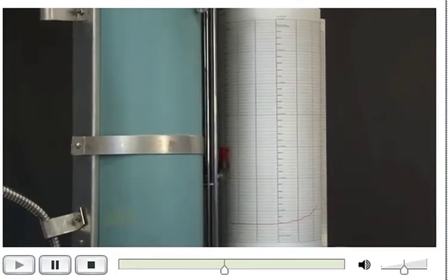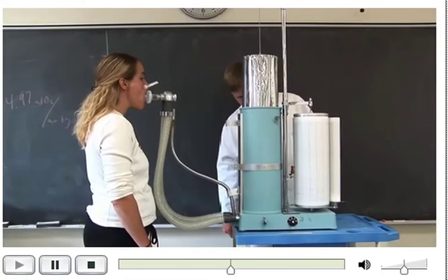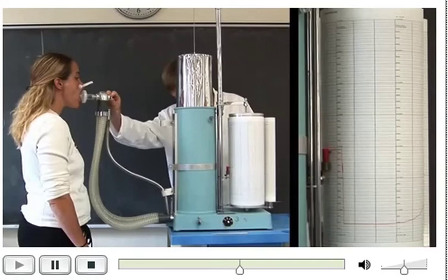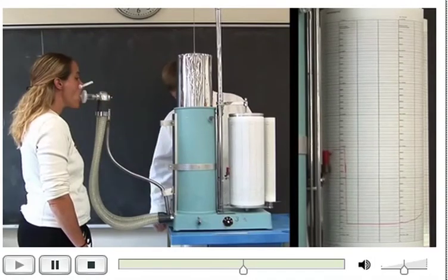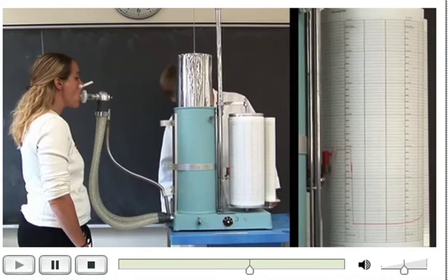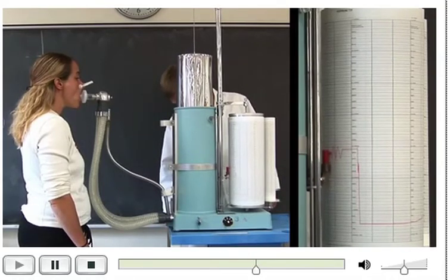Go ahead and breathe. Breathing to the air. Now again, small volumes. Now breathing to the device with the obstruction in place. Normal tidal volumes with the obstruction.